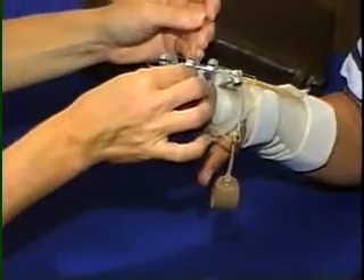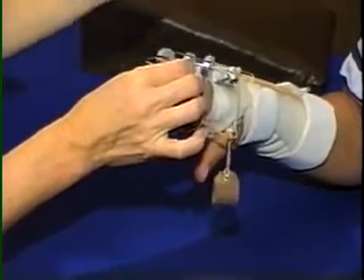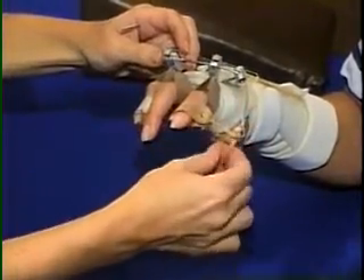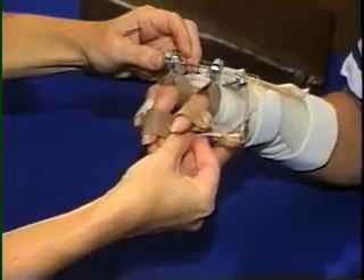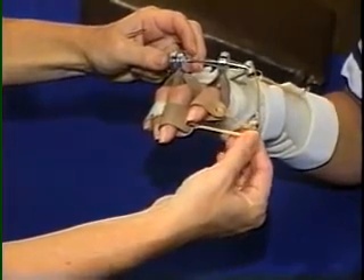If correction of a rotation deformity is needed, dorsal and radial forces are placed at an angle to achieve a force couple effect. Dorsal alumo foam splints may be needed to support the PIPs.